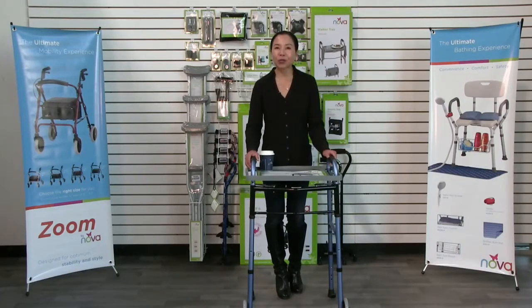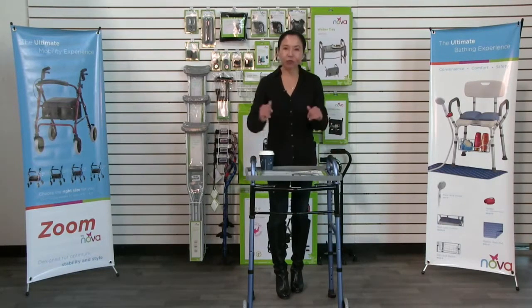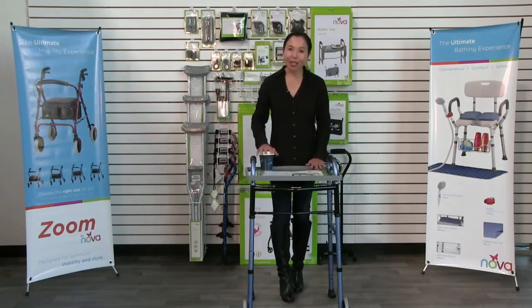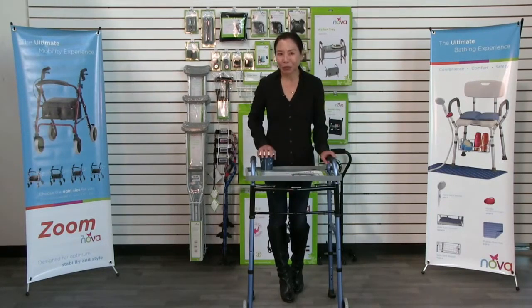Hi, this video is about the Nova 439T tray for folding walker. This is a great accessory and add-on for your folding walker so you can carry food and drinks and small light personal belongings.